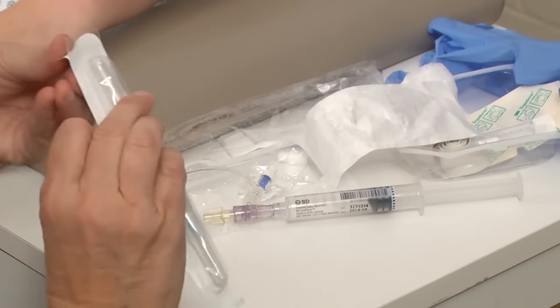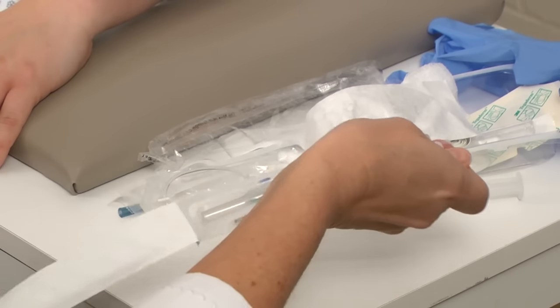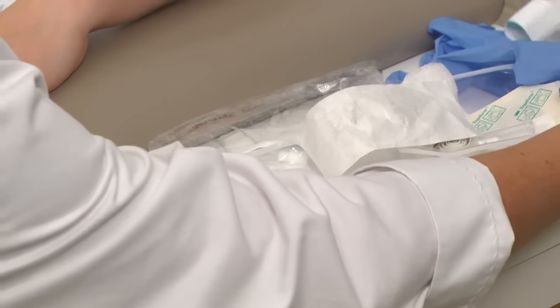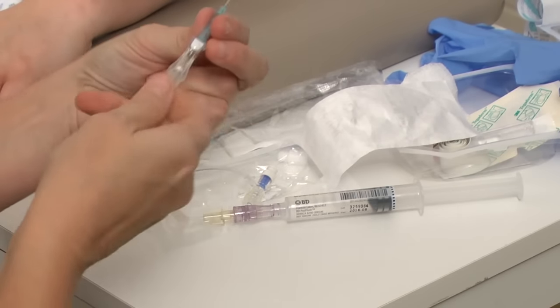Next, prepare your angiocath. You will need to release the catheter from the needle now to aid in insertion. This is done by a slight twist of the catheter. This is also a good time to reassure your patient.